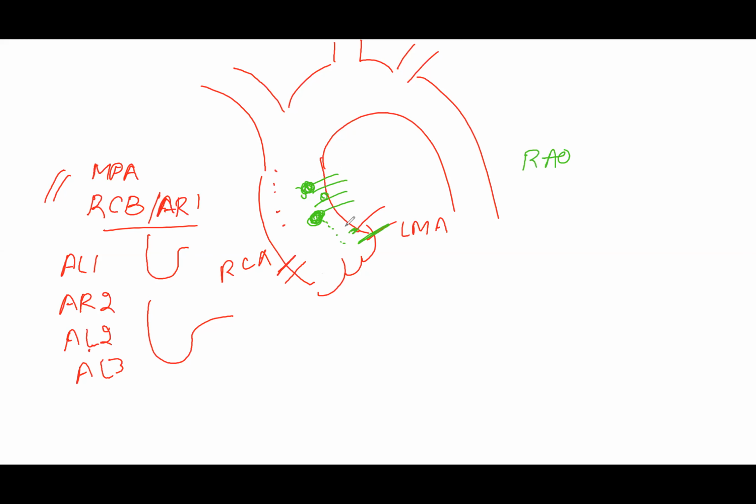Okay, so then you use that. I use the JLs first. Then if it doesn't work, Tiger is great. If that doesn't work, then I start going to the ALs. AL group, AL 1, 2, depending on what the size of the aorta is.